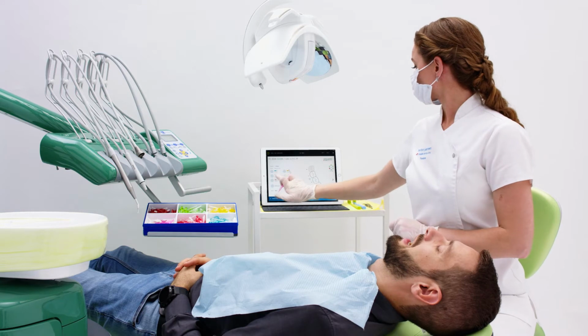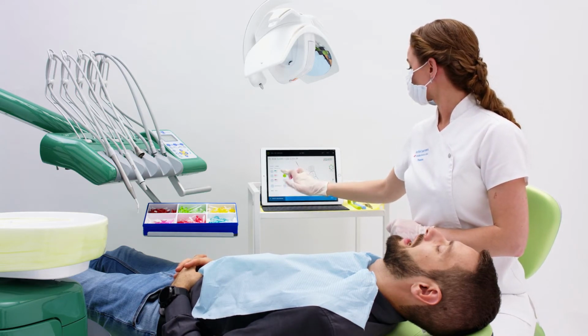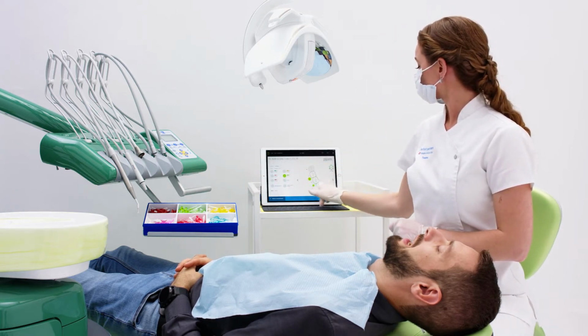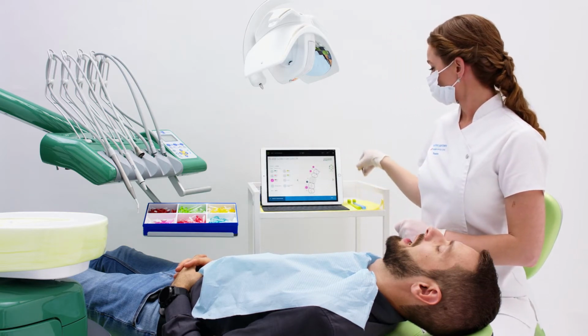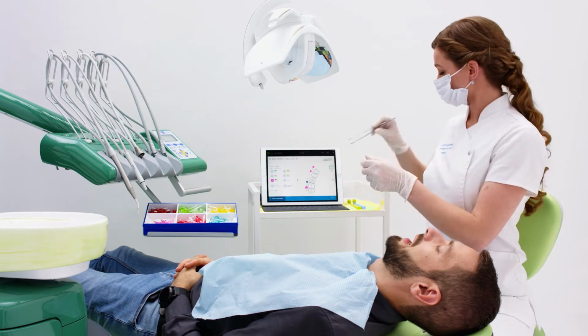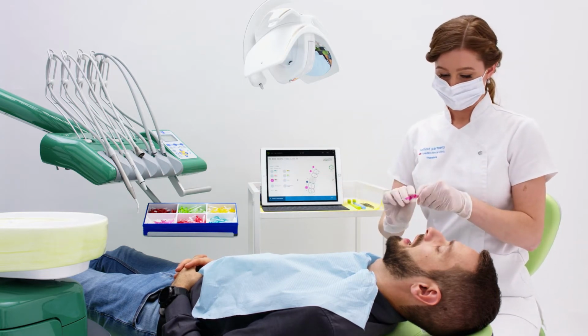I then return to the upper right sextant, where I can now begin the bleeding on interdental brushing index by using the interdental brushes. I can now view what interdental aids I need to use, as the colours match with those of the IAP. I now begin with the pink prime interdental brush.